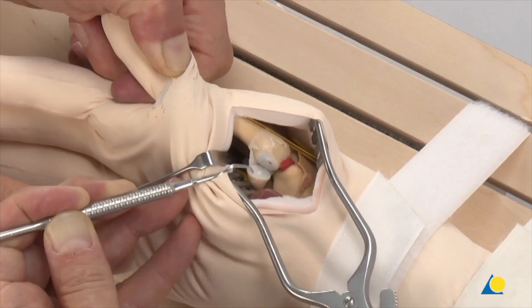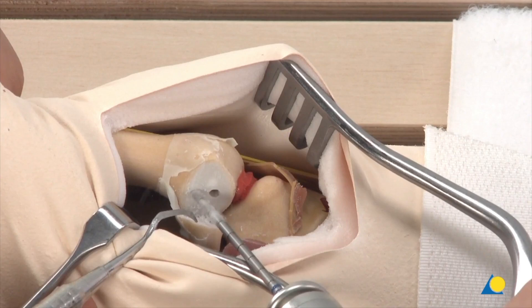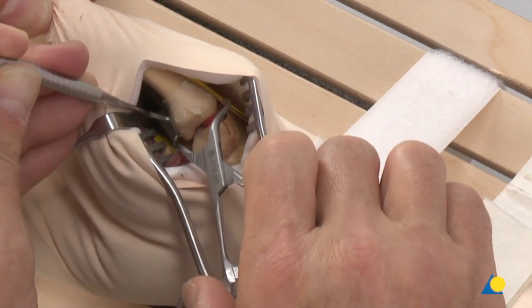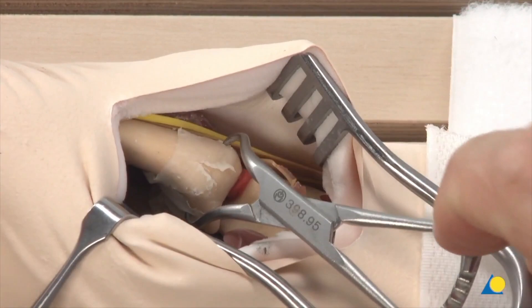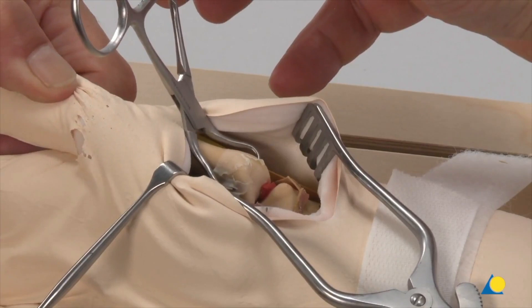The second gliding hole is drilled distal to the first one in the same manner. The fracture is reduced by pulling on the thumb and rotating the first metacarpal in pronation onto the Bennett fragment. The Bennett fragment is then stabilized with a small pointed reduction forceps, and the reduced articular surface is checked for smoothness. Pronation of the first metacarpal bone will expose the superficial branch of the radial nerve and the dorsal exit points of both gliding holes.